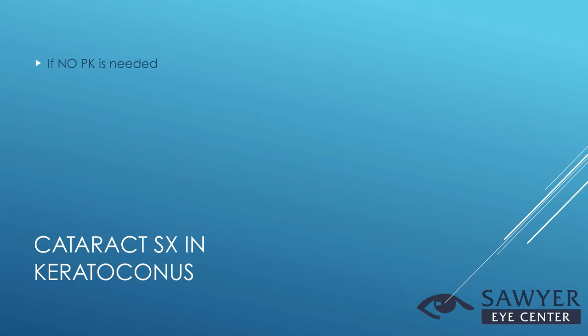In anyone with an irregular cornea, I want to make sure that my refractive axis is stable, and then to make sure the toric alignment is at least close to that axis, or at least makes sense with it. I find the most wild refractions are when the toric does not align with their pre-op refraction. I never ever promise glasses freedom in these patients. It's very rare to get them completely to plano sphere or close to that.